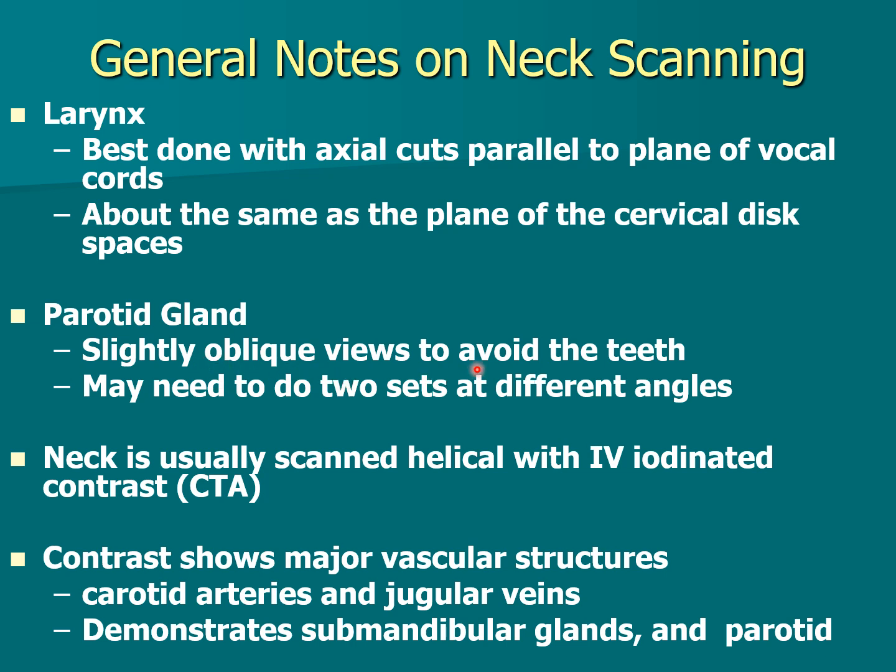So slightly oblique views to avoid the teeth. If you're doing those, it's usually because you have fillings in the teeth. You may need to do two sets at different angles, and we did. We had to do them at different angles because, again, we were not able to do the 3D reconstructions.